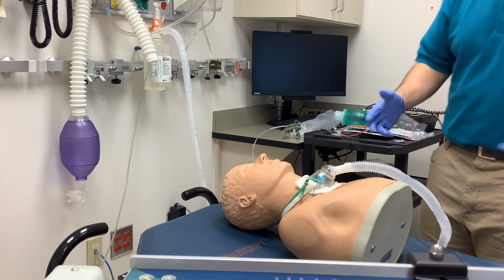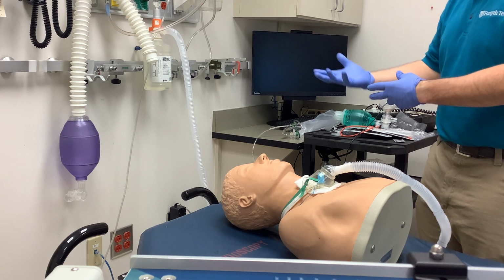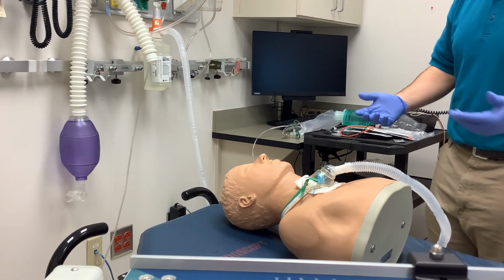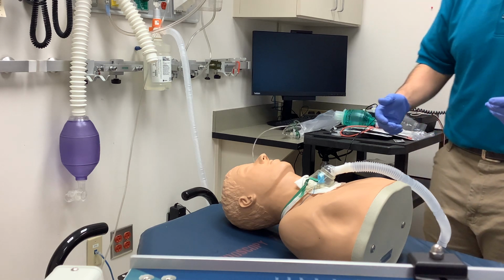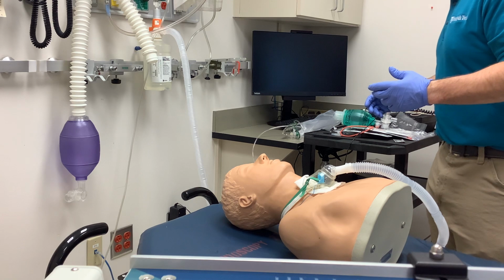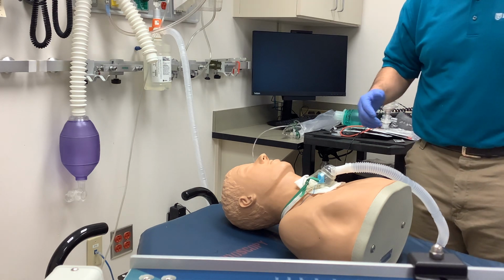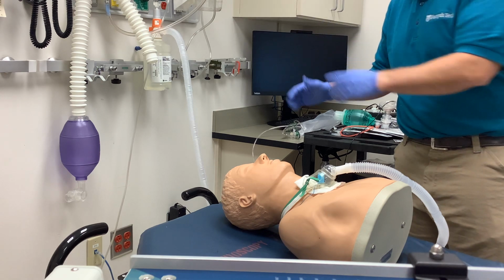Now, I will tell you, it takes a little bit of coordination. That wasn't terrible to be able to maintain a sterile field to go through and do that. But I'll show you an adjunct that you can utilize in the future without having to utilize sterile technique per se.